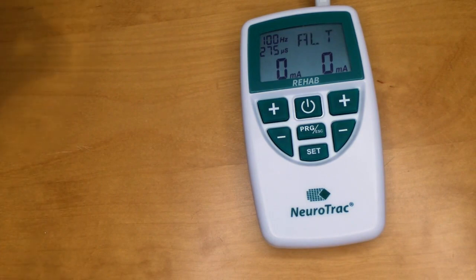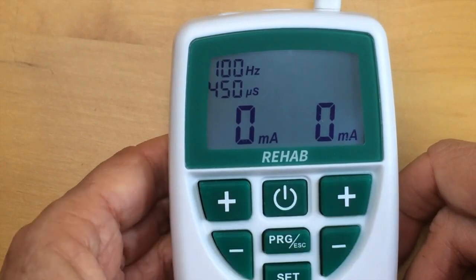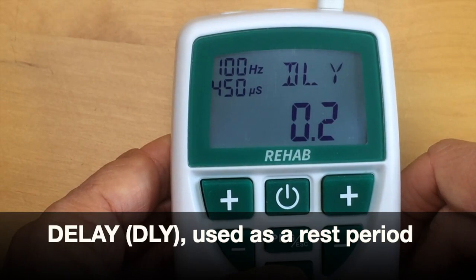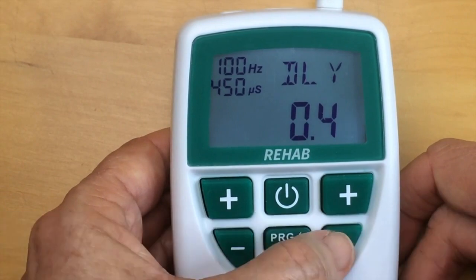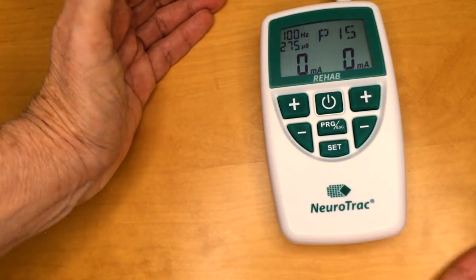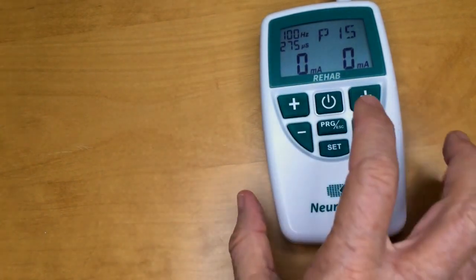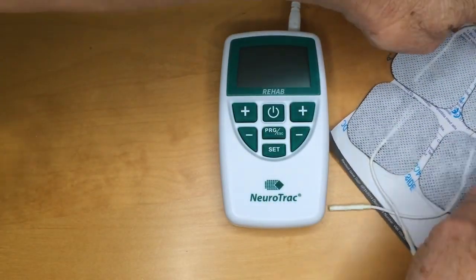You change from synchronous to alternate by pushing the plus button. The last setting is delay (DLY), used as a rest period between one group of muscles activating and the next group coming on. And you've done it — you've set up your device. You can push program escape or turn it off and all the settings will remain. Now you are ready to put the electrodes on your client.